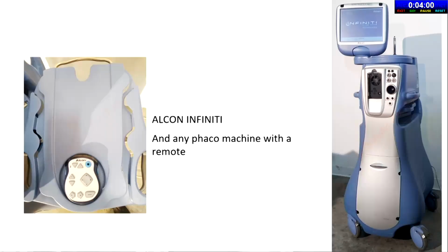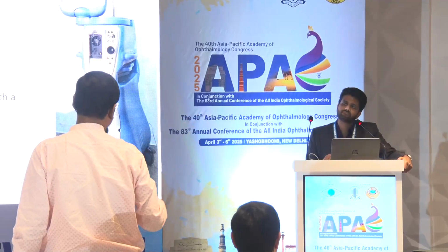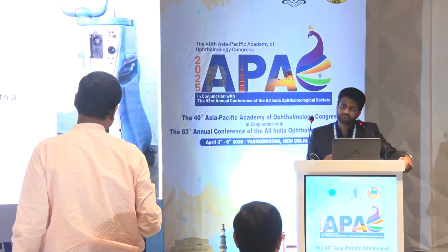You are a very good example of how well the younger ophthalmologists are adapting to newer technologies. Very, very good. One question, sir. Are there any prohibitory laws, like patent laws, which you have to take care of in developing these devices?